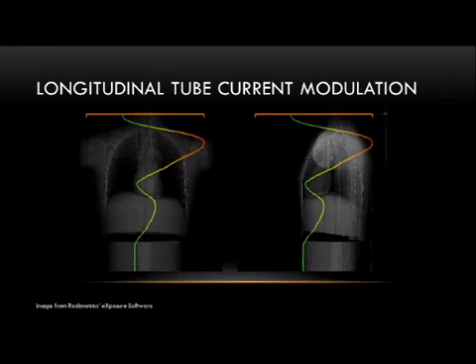Here's an example on a combination of phantoms that were scanned showing in the neck, low tube current, increasing through the shoulders, then coming back down through the chest, increasing in the abdomen, and then kind of flat here where there's no change in attenuation along this length. Again, it's not instantaneous. It averages out because your beam is not infinitesimally small. It's got some size to it, and you may have different parts of the anatomy in your collimation as you're going through.